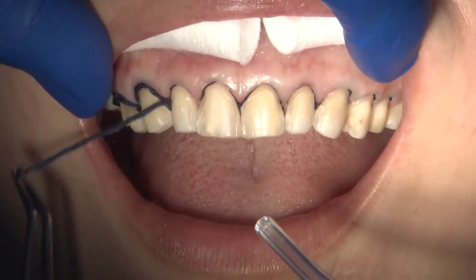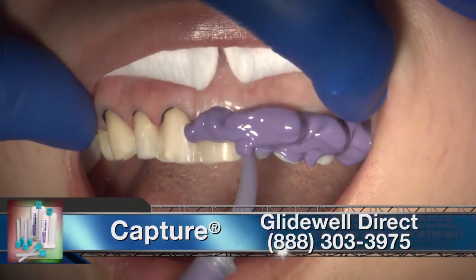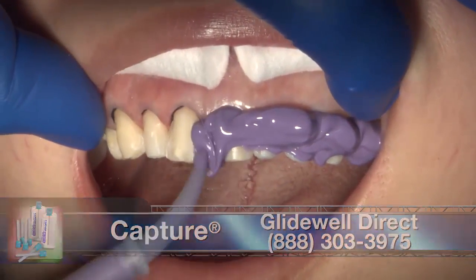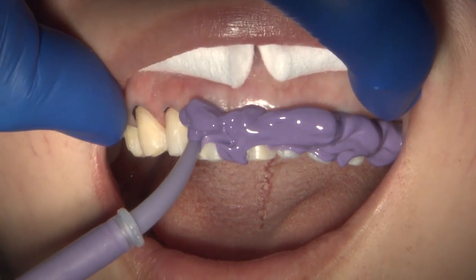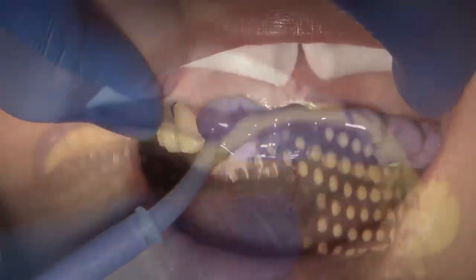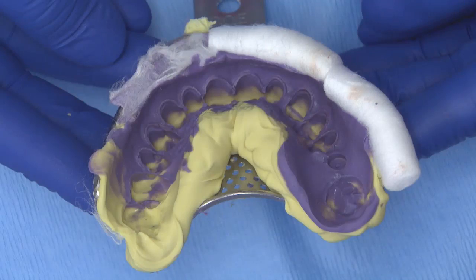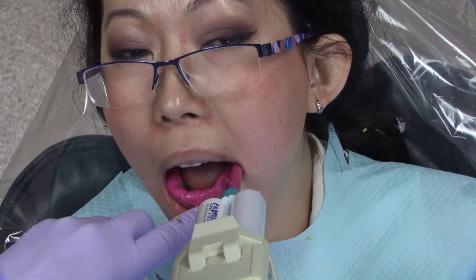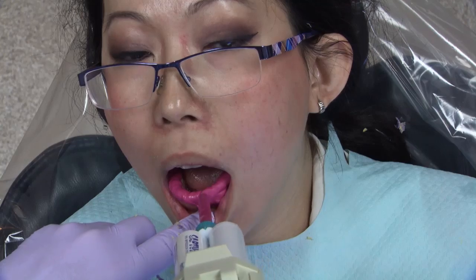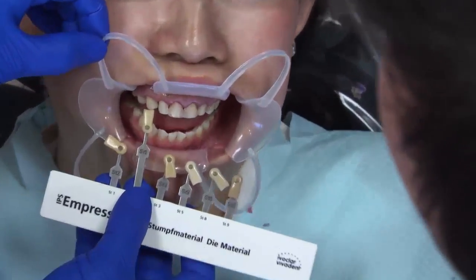After removing the second cord, I used the Capture vinyl polysiloxane impression system. I syringe medium body on the prepared teeth while my assistant was loading up the tray. A full arch impression tray was filled with Capture heavy body. The impression was left to set in the patient's mouth for three minutes. Also, a hard bite was taken with Capture material.